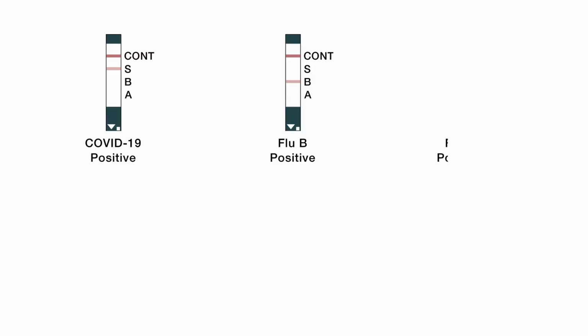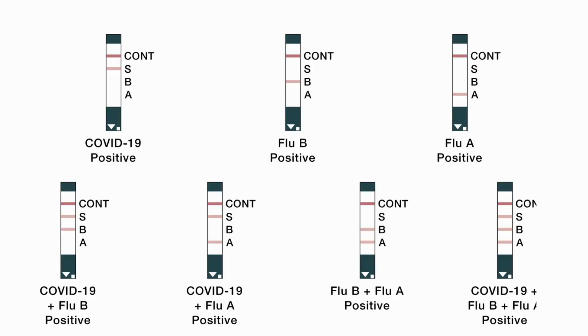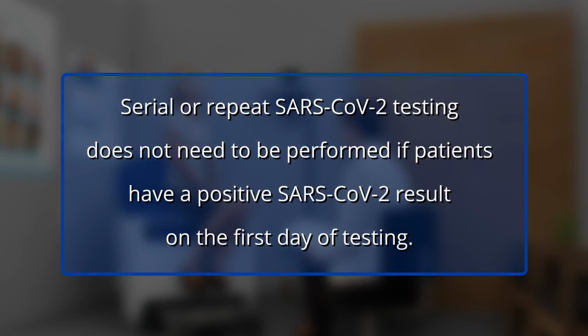Please follow the table shown on screen and found in the instructions for use when interpreting test results with symptoms. Serial or repeat SARS-CoV-2 testing does not need to be performed if patients have a positive SARS-CoV-2 result on the first day of testing.